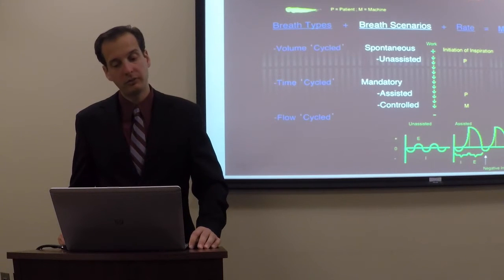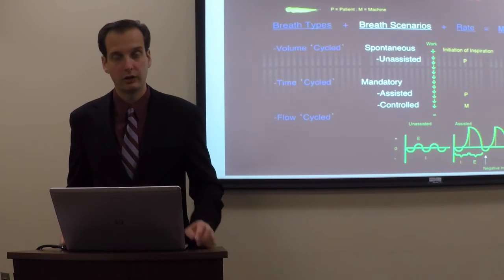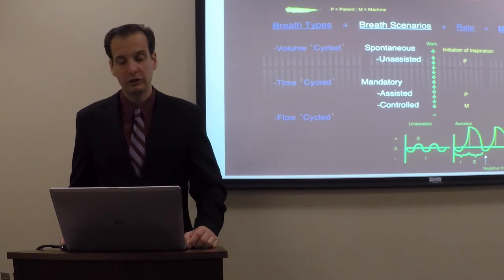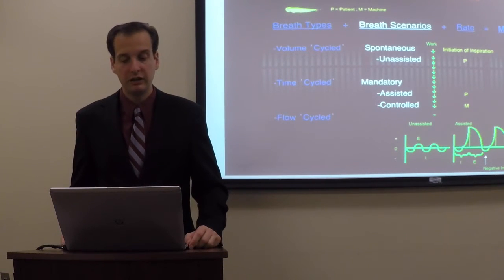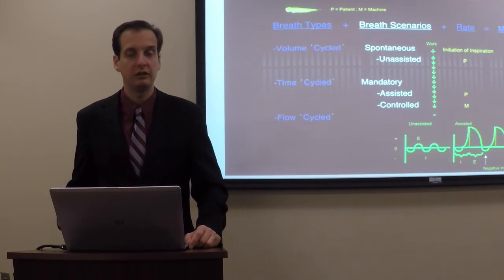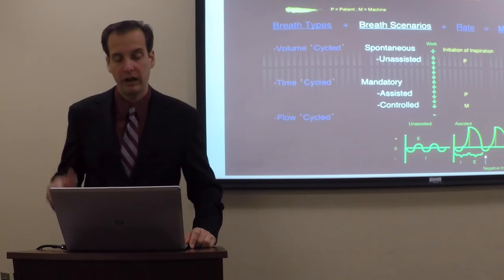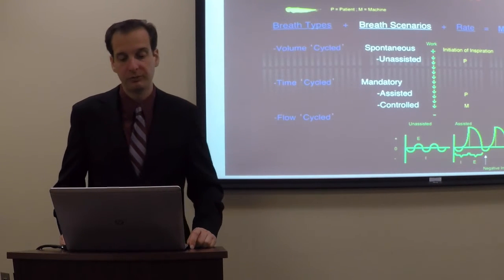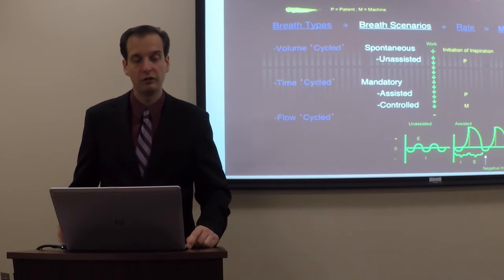And we talk about inspiration only because by doing so, we by default talk about expiration. So the termination of inspiration is the beginning of expiration, and the initiation of inspiration is the termination of expiration. So by actively talking about inspiration, we passively talk about expiration. So in spontaneous breathing, the patient is starting and stopping, they're doing all the work.